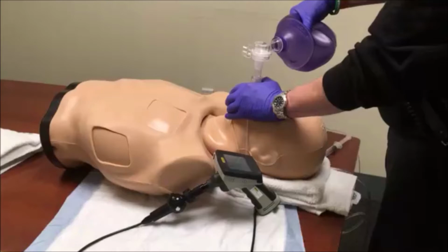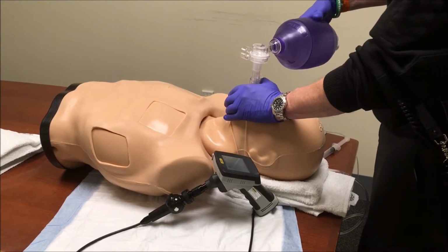He's been optimally prepared for intubation with good oxygenation and good end-tidal capnography. Because we do not have approval to conduct an RSI procedure, we're going to perform a nasal intubation. Because blind nasal intubations have a poor success rate, we're going to use a flexible endoscope to ensure visualization of the glottis during the procedure. The plan is to insert the endoscope through the NPA on one side of the nose and insert the ET tube through the other side.